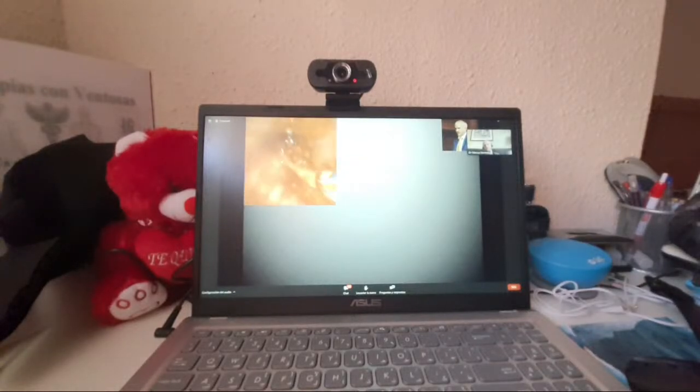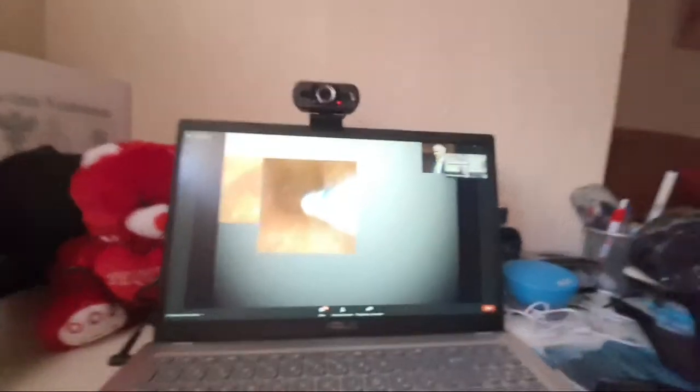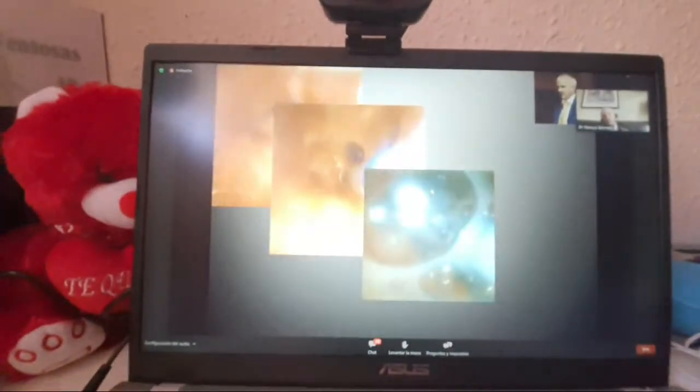So this is just an endobronchial biopsy using this scope. Then next we have a cryobiopsy. Yeah, so this is a cryobiopsy just to get a larger endobronchial sample for analysis. So it works just fine for all this. We did some argon plasma coagulation. Now the scopes are not licensed for electrocauteries yet, but I was able to do it.